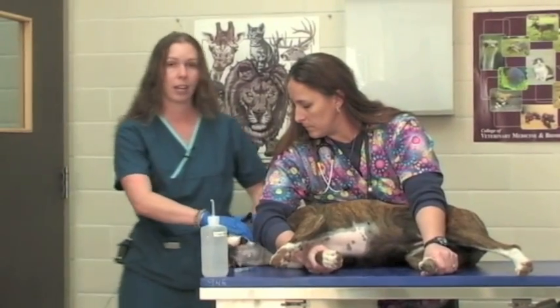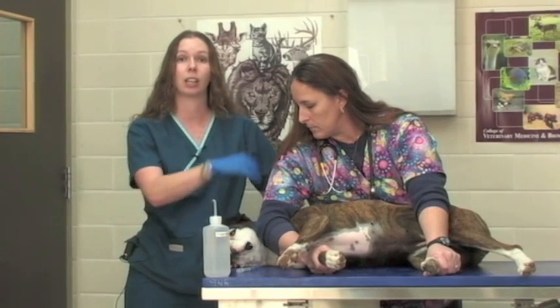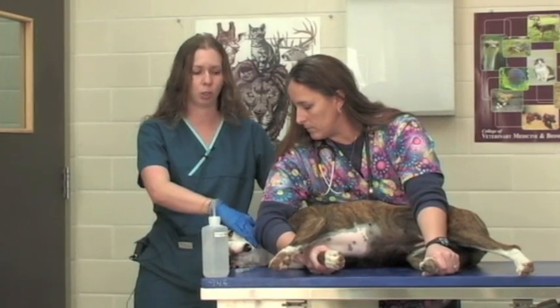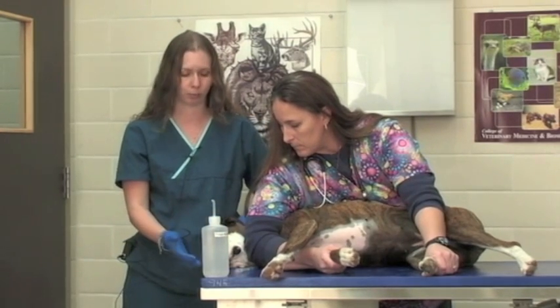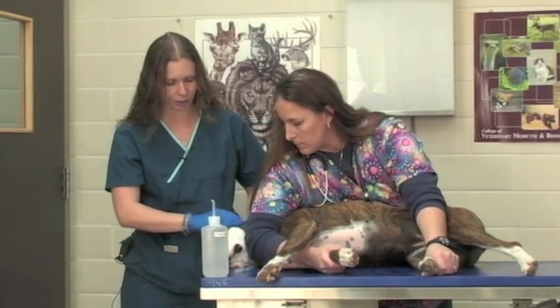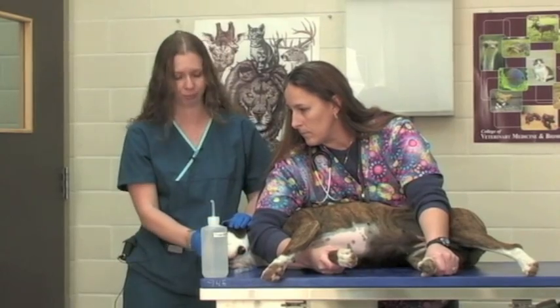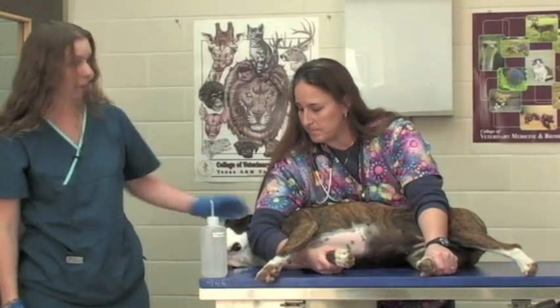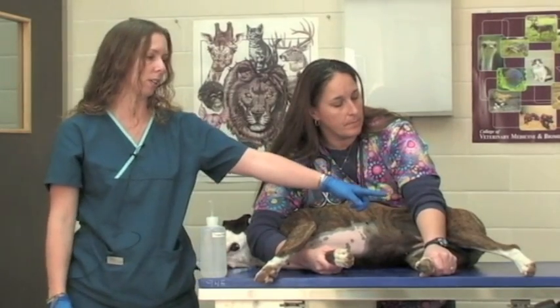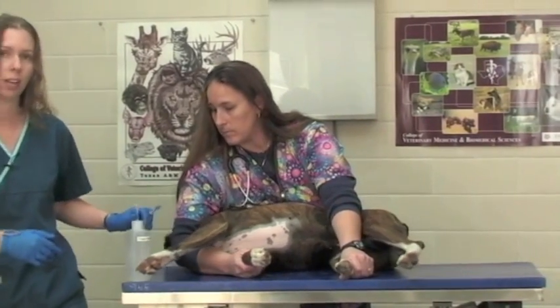You also want their head to be behind your elbow when they're in lateral recumbency so that if they try to get up you can use your elbow to apply gentle pressure on their neck so that they continue to lie down. This can also help prevent your restraining person from getting bitten if a patient offers to bite. The vessel we're going to draw blood from is the lateral saphenous vein on her left rear leg.